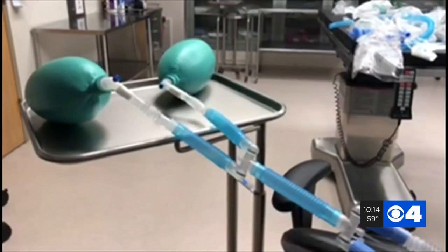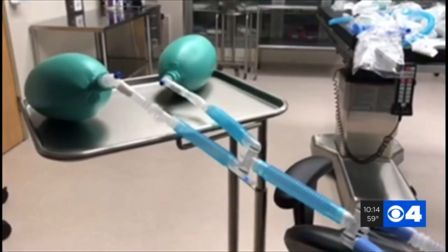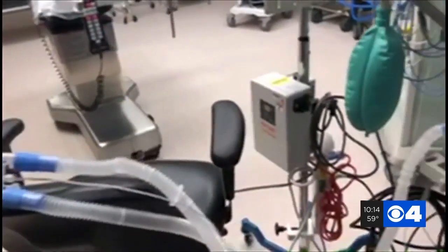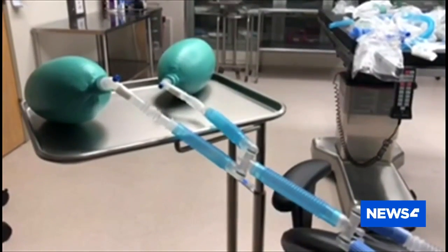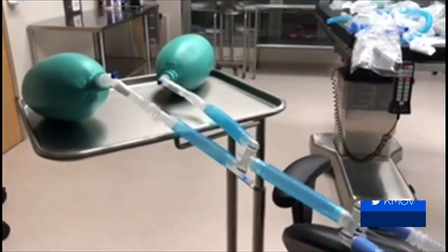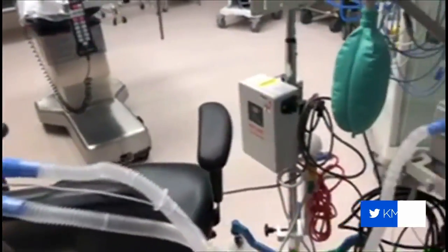There is a desperate need for increasing the numbers of ventilators. Dr. John Fontana with St. Joseph Hospital in St. Charles says he's looking to educate more medical professionals on capabilities to expanding the use of a single ventilator to benefit two patients. You take the end of the ventilator circuit that would normally go to one patient, and you're splitting it for two patients. It's not difficult, but it's very crude, analog, old school materials.